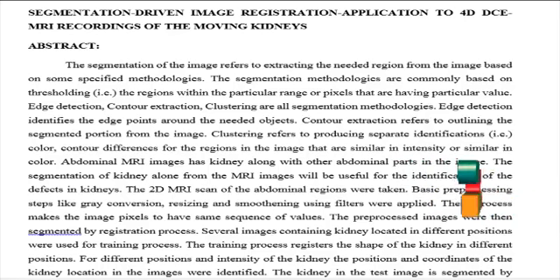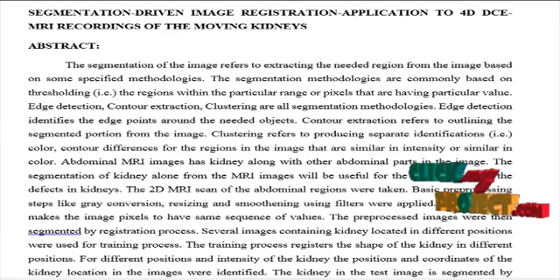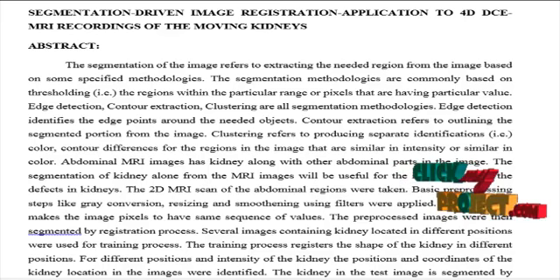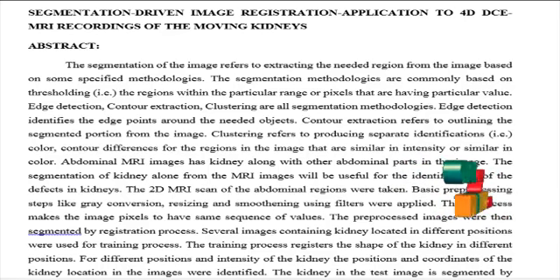The calculation of the mean value of the images will give the information regarding the intensity of the images. The matching process compares the intensity and selects the kidney portion that is extracted from the images. This process is done with the help of the active contour methodology. The shape in the dataset that matches the input test image is identified with the help of distance calculations. The distance will be minimum for the most matching kidney portion in the images.